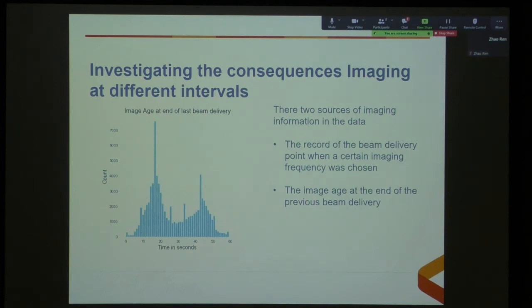the last beam delivery. And this is a more continuous column because the reality is that the radiation therapist might set it at 15 seconds, but CyberKnife can't image while the beam's being delivered, so it might range from 12 to 17, 18, the actual time that has passed between the 2 images. So this gives a bit more of a continuous data set.